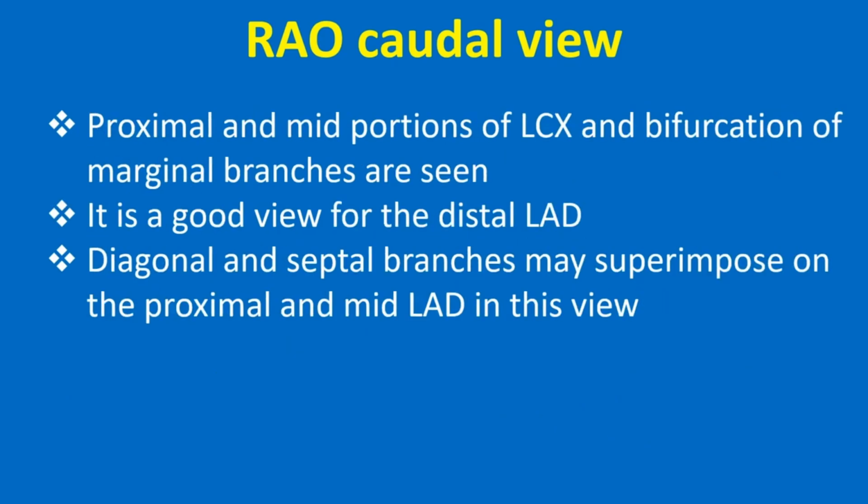Proximal and mid portions of LCX and bifurcation of marginal branches are seen. It is a good view for the distal LAD. Diagonal and septal branches may superimpose on the proximal and mid LAD in this view.